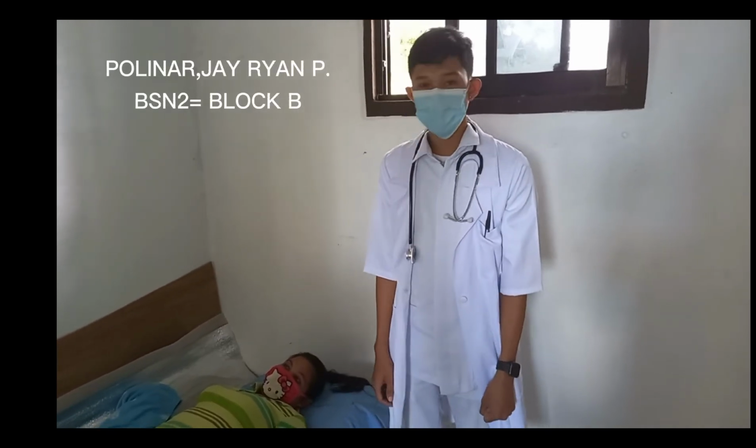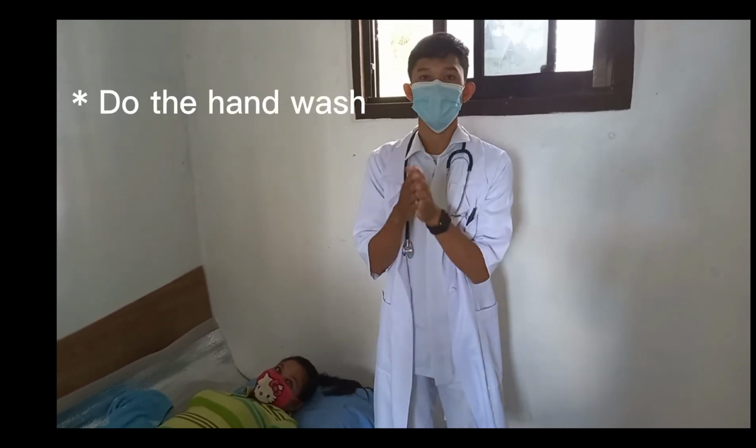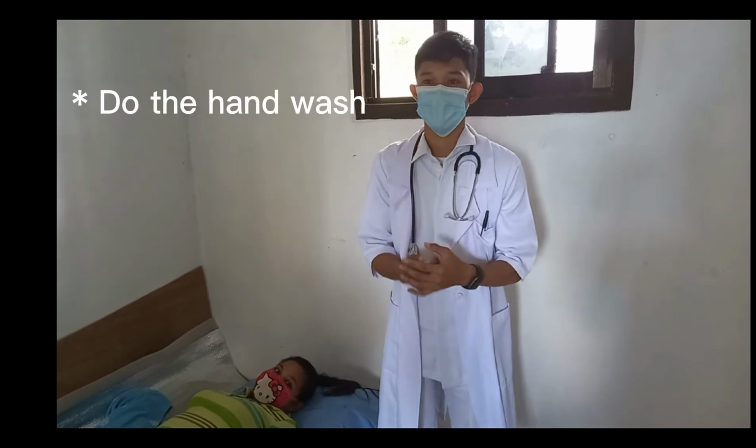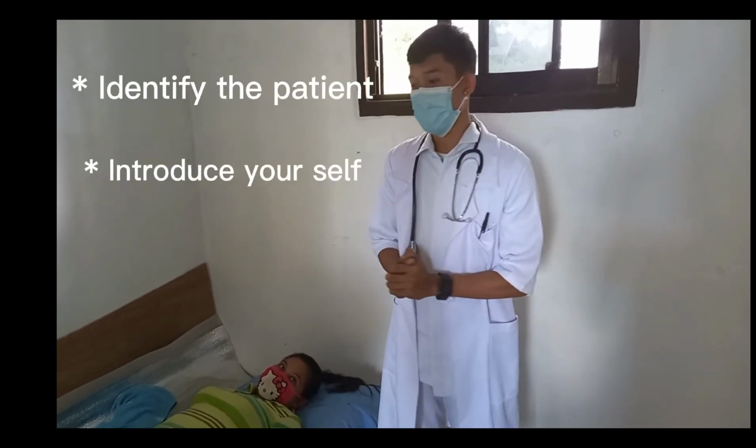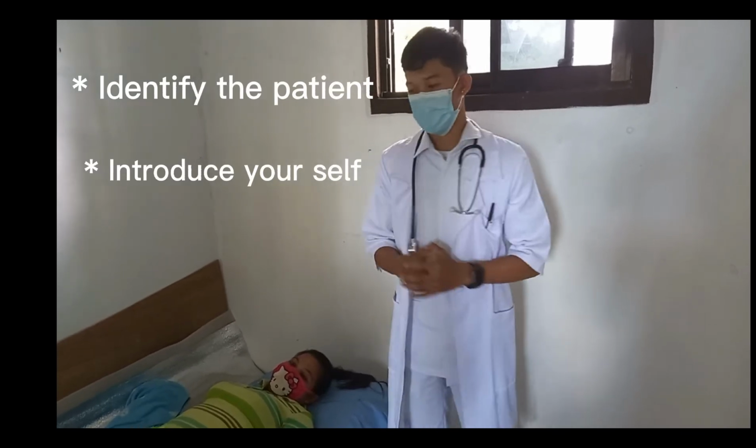And now, I will be performing the fetal heart monitoring using a stethoscope. First, I will do hand hygiene. Next, I will identify the patient and introduce myself.